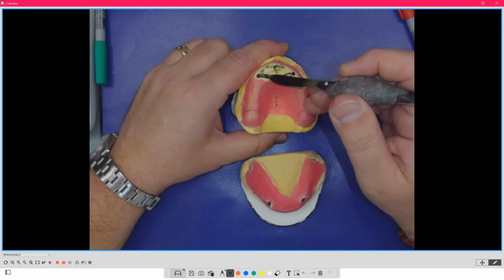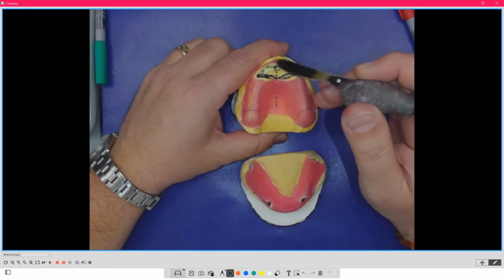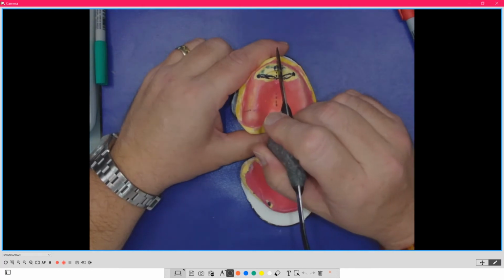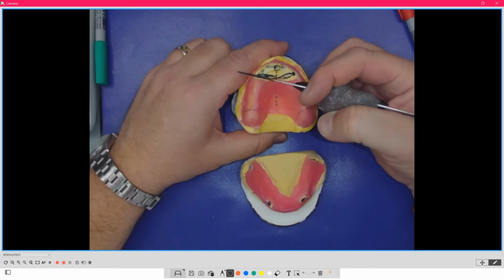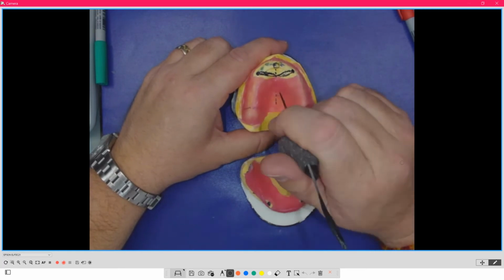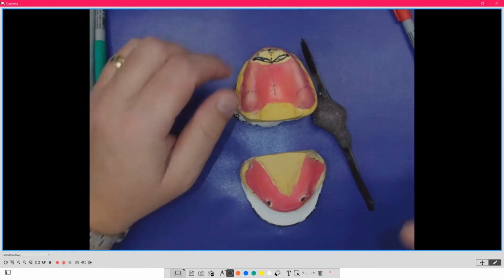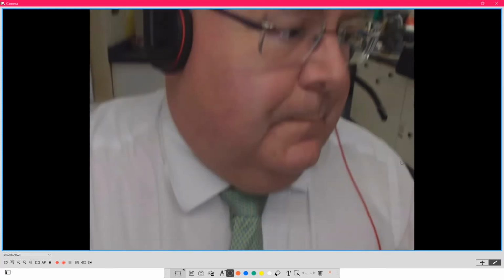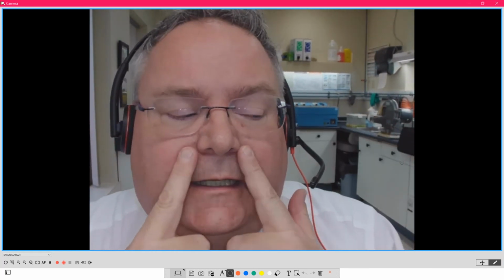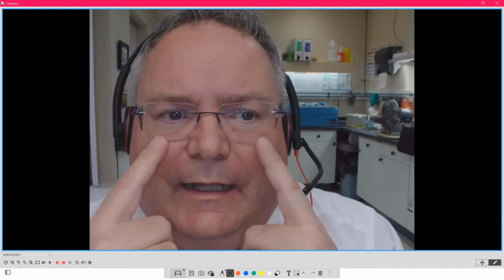The long branch rugae always points to where the canine goes, or the cuspid goes. So again, I come back to the golden proportion rule. When I start setting teeth, my cuspids should be at the end of that long branch rugae pointing. If that's the case, then I know I'm golden proportioned for this patient on this model, on this person. That means the teeth are going to fall in the correct position of their face. Okay, so it's important that the canines follow right here on the canine eminence, pushing out, because that's right where my nose is, and everything again is mathematically equated.